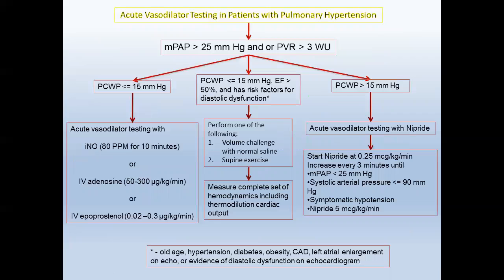Okay. So moving on now, once you have this, what do you do with the vasodilator study? That's where so much confusion happens. So, broad strokes: vasodilator studies are done for different reasons in different settings. In patients with PAH, or group 1, which is what I deal with, the reason to do a vasodilator study is to see whether I can treat them with calcium channel blockers or not. If they vasodilate and I give them calcium channel blockers, their survival is pretty good.